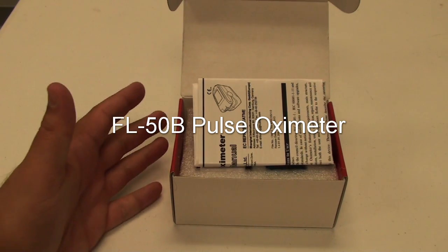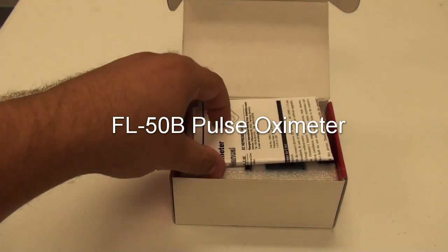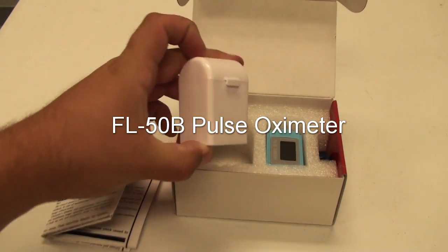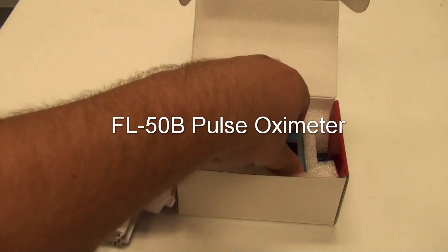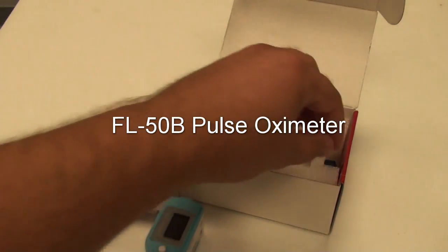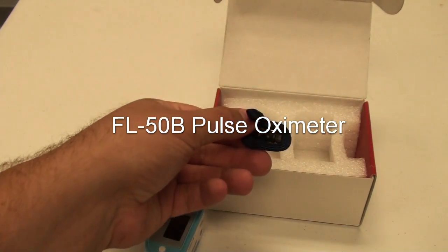Hello and welcome to the unboxing of the FL-50B pulse oximeter. In each box you will receive an instruction manual, a hard case carrying case, the device itself, and a lanyard.